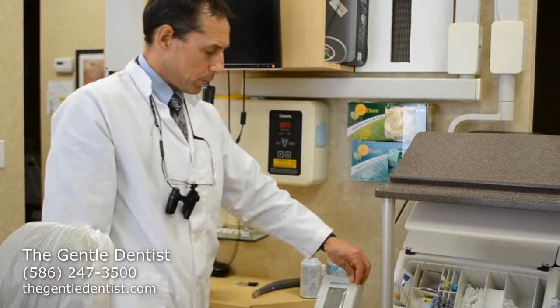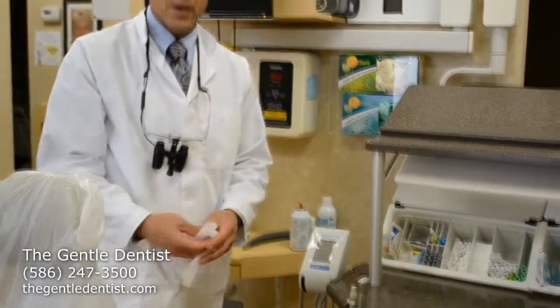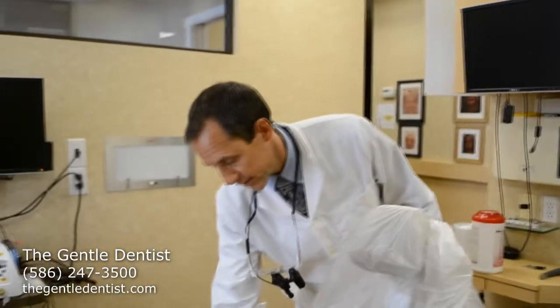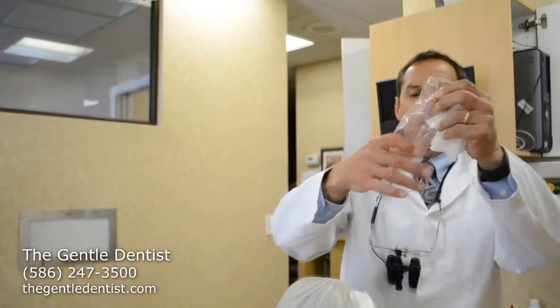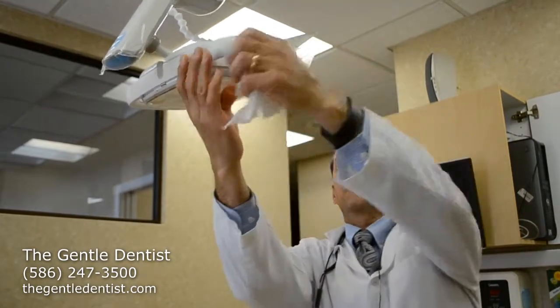For example, for plastics, this is for our handpiece, a controller for our electric handpiece. This has plastic on it that will get disposed of. Also the chairs have a fresh plastic. Every time a new patient comes in, they get a separate new piece of plastic here that protects your head and anything else from recontamination from people. Also any of the controllers that we have, for example down here, are covered with plastic. And even the handles on our lights, we use a plastic like this, and that goes right over the top of it like this. That way we can control it, and when we're done, we go ahead and remove that and dispose of that.